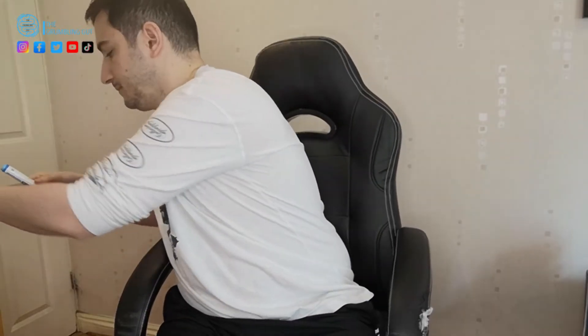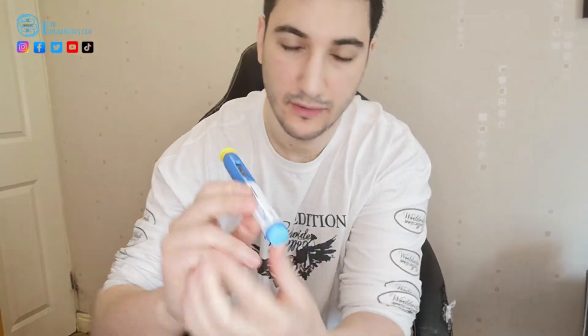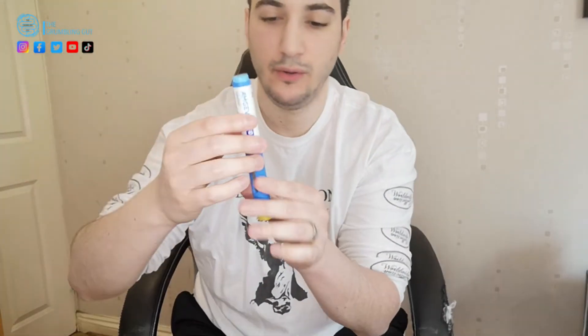Okay, so Amgevita — take it out of the box. This is what it looks like. First of all, before you inject, if you see the clear fluid here, just make sure that it is clear. It looks pretty good to me.